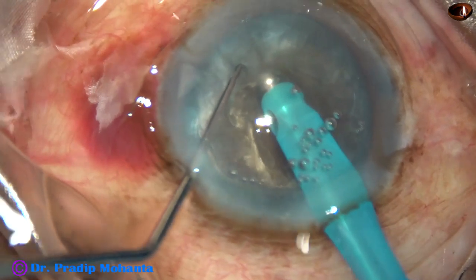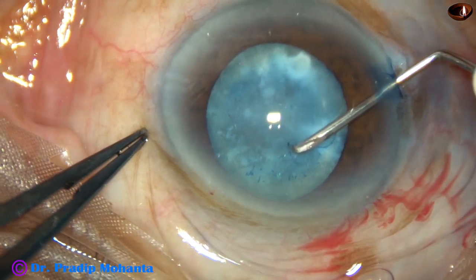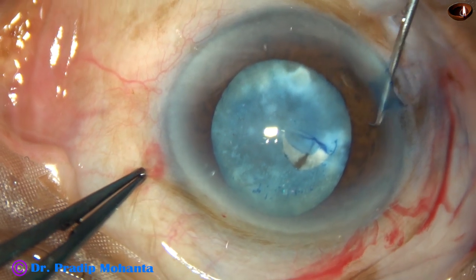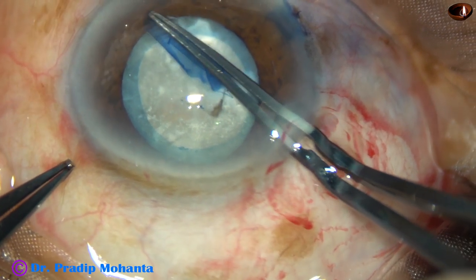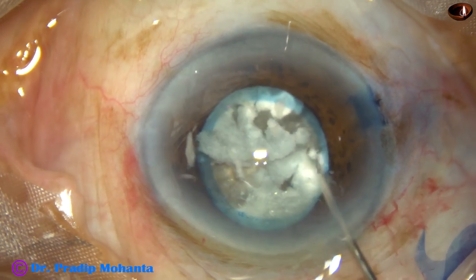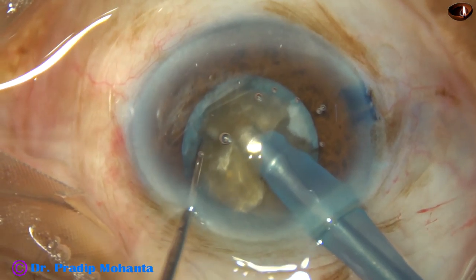Holding 180 degrees away, along the initial crack the nucleus divides into two halves. This is a hypermature sclerotic cataract. In this case there is no milky fluid — all the milky fluid has been absorbed and the epinucleus has become like thick cortex. Capsulorhexis is completed and we can see the epinucleus has turned into this kind of material. This is the typical hypermature sclerotic cataract.